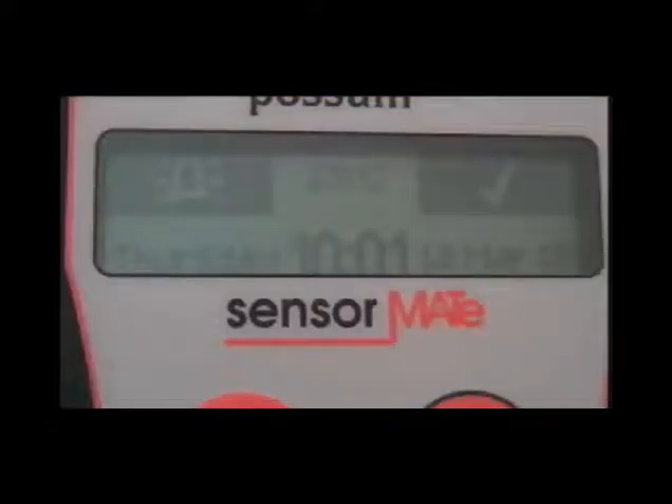Once the top sheet has been placed over the mat, the system can be easily tested by placing a hand across the sensing elements on the mat. The Sensormate display will show a tick when the hand is present across the sensing elements, and an alarm bell when it is removed.